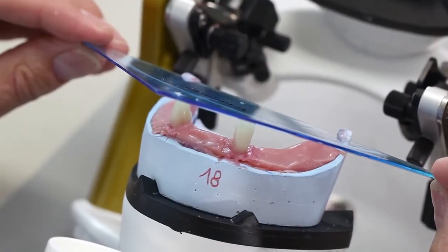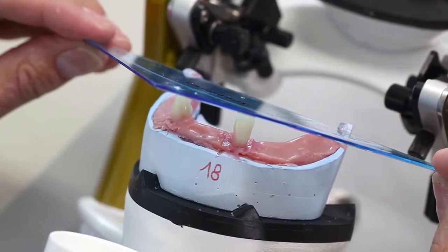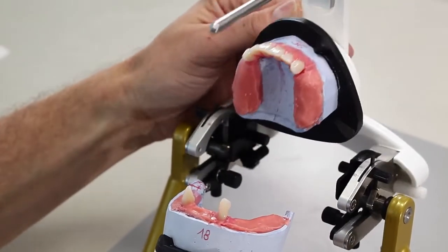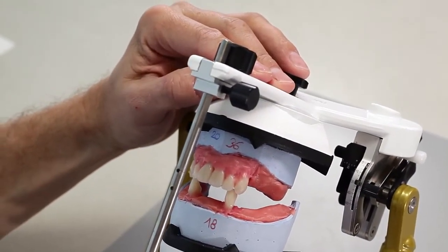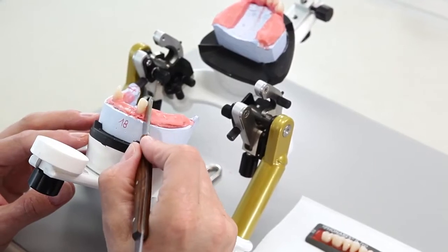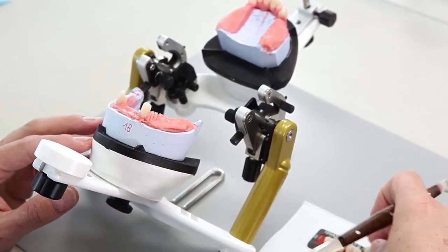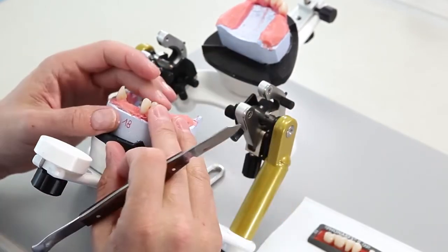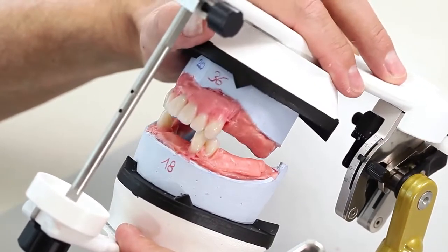Basically, bilateral symmetry to the setting up template has to be kept in mind during the setup, in other words, the average value orientation. It's important to set up the canine out of contact, which ensures reliable group guidance in the posterior region. Position the first premolar in such a way that a smooth transition to the canine is achieved. This means that the distal slope of the incisal edge is flush with the mesial rise of the first premolar.